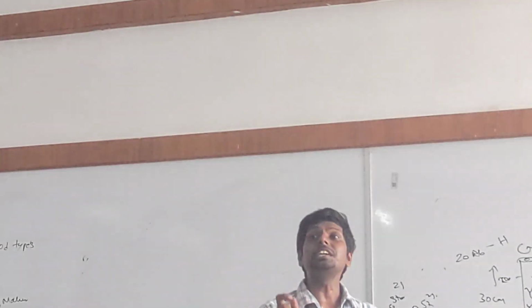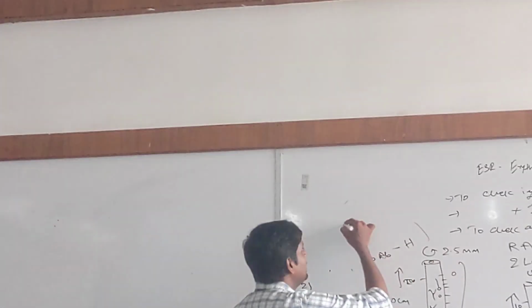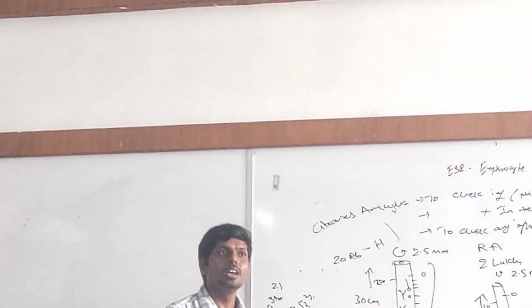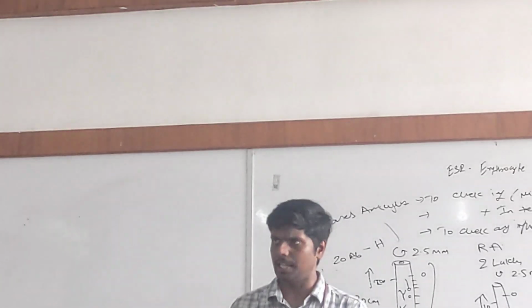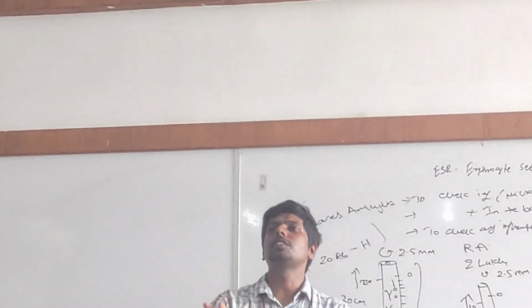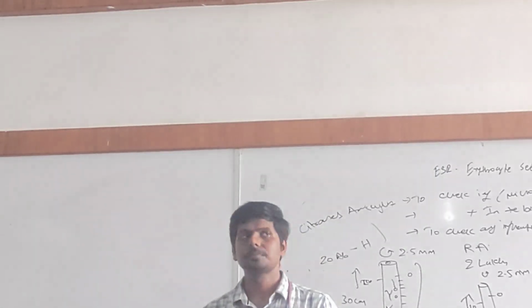We need citrated anticoagulant for the purpose of ESR studies. Now you understood, right? Because citrated anticoagulants won't alter the viscosity of the blood.